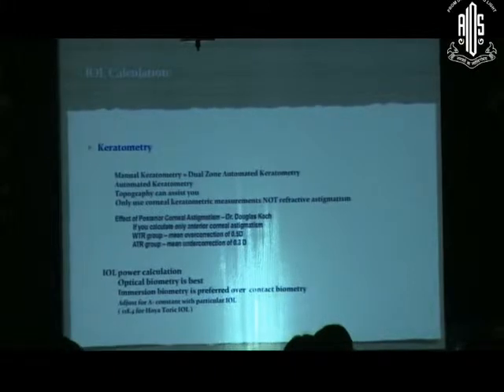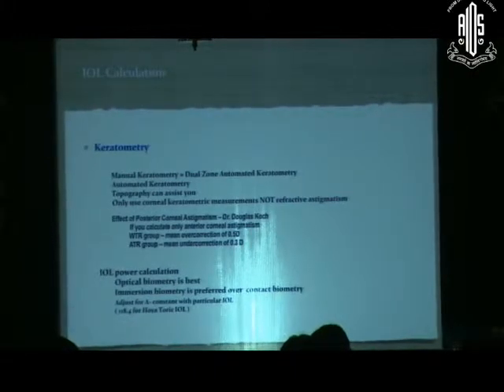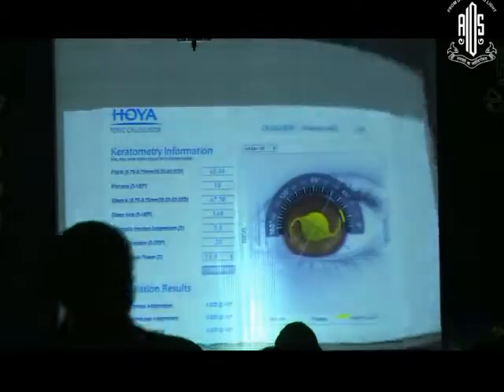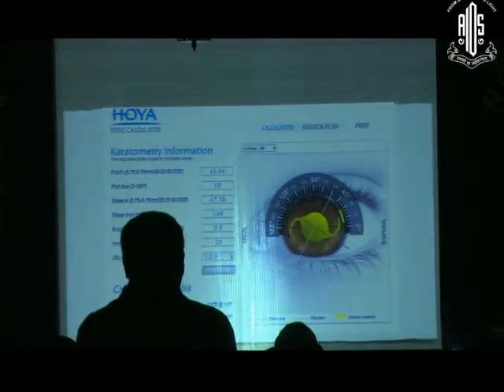It's not that when you have a toric IOL patient, you take them for this, because this marking of the IOLs, then putting the IOL at a particular axis, can all be done in any normal patient. Once you do this in 10, 12, 15 patients, you get used to all these things. So I'll take you to the procedure: once we have the desired axis where we want to implant the IOL, how to go about it.